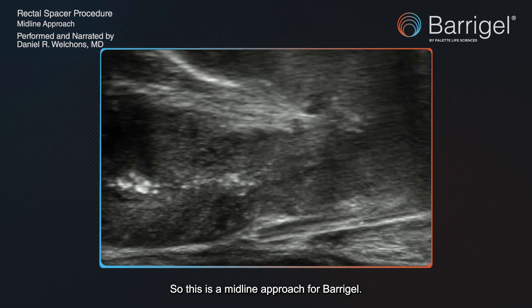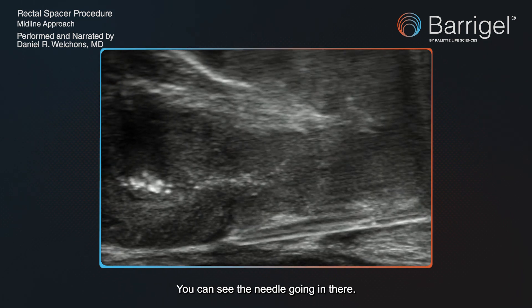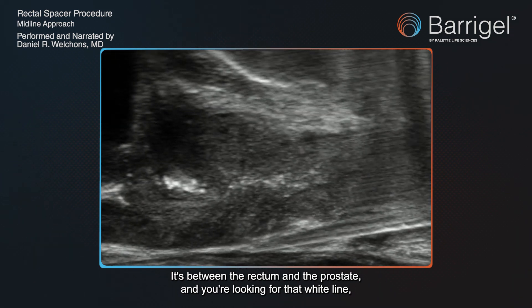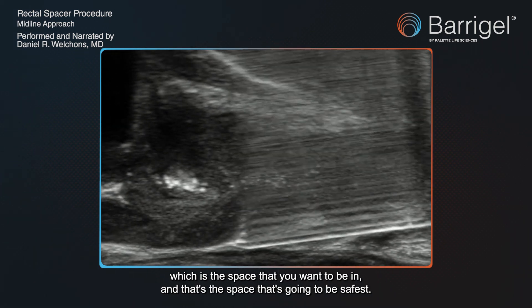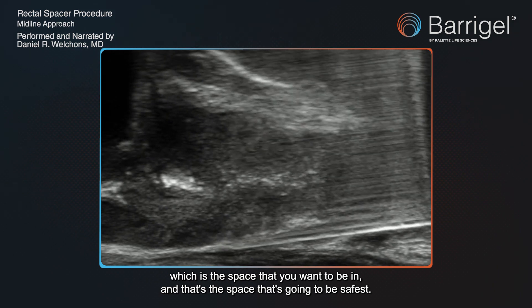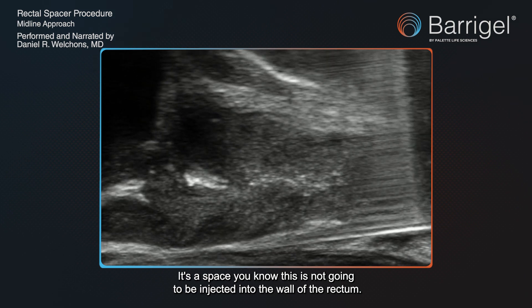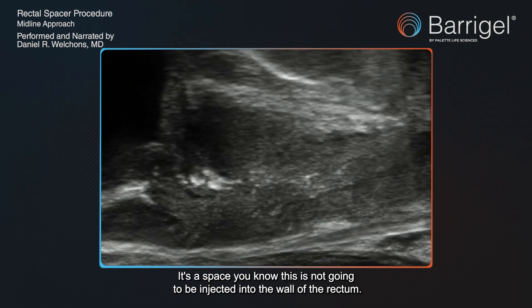This is a midline approach for Baregel. You can see the needle going in there. It's between the rectum and the prostate, and you're looking for that white line, which is the space that you want to be in. That's the space that's going to be safest — the space that you know is not going to be injected into the wall or the rectum.